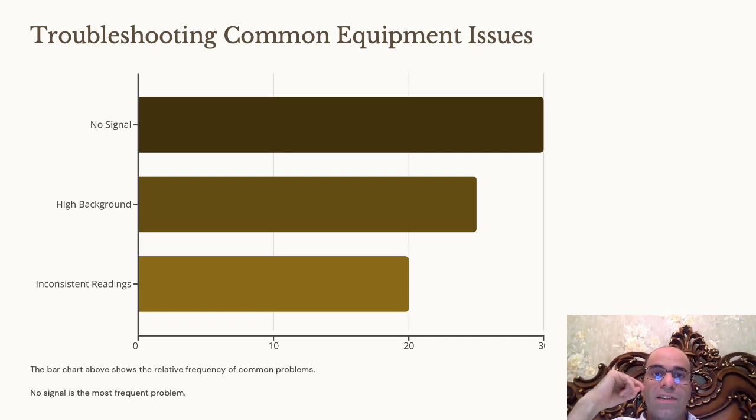This typically stems from number one, insufficient washing between steps, number two, cross reactivity with non target molecules, number three, contaminated reagents or equipment, and number four, non-specific binding to assay surfaces. And the last bar is about inconsistent readings. Variability between replicates undermines result reliability.